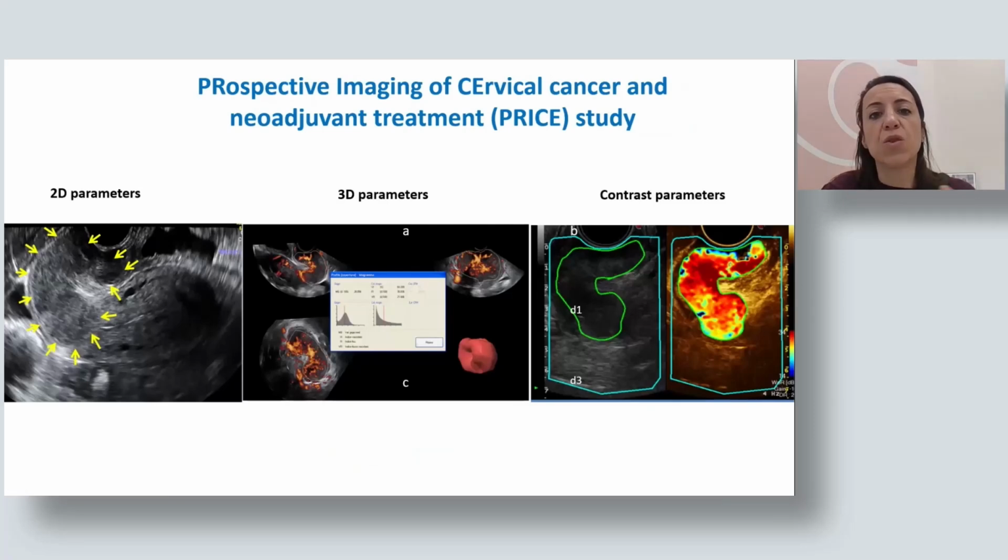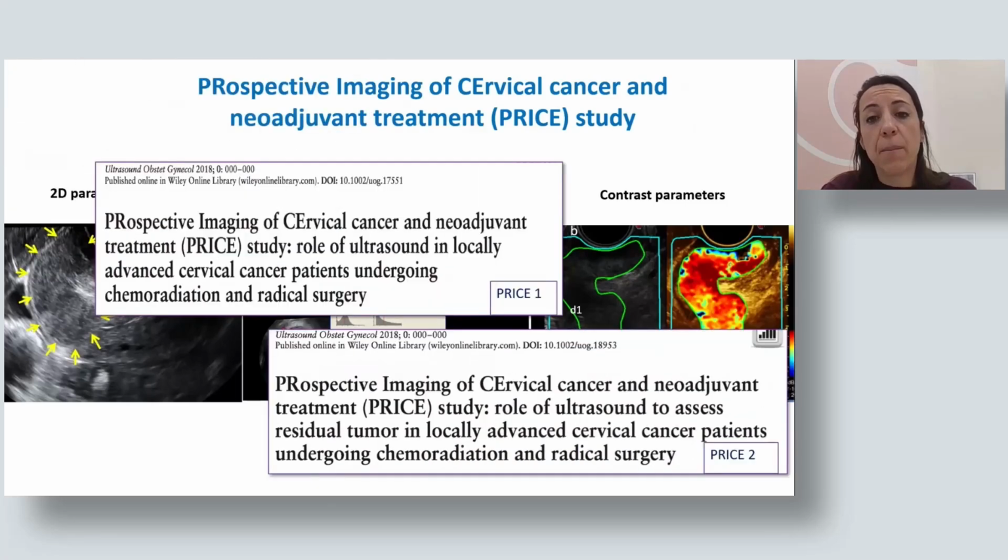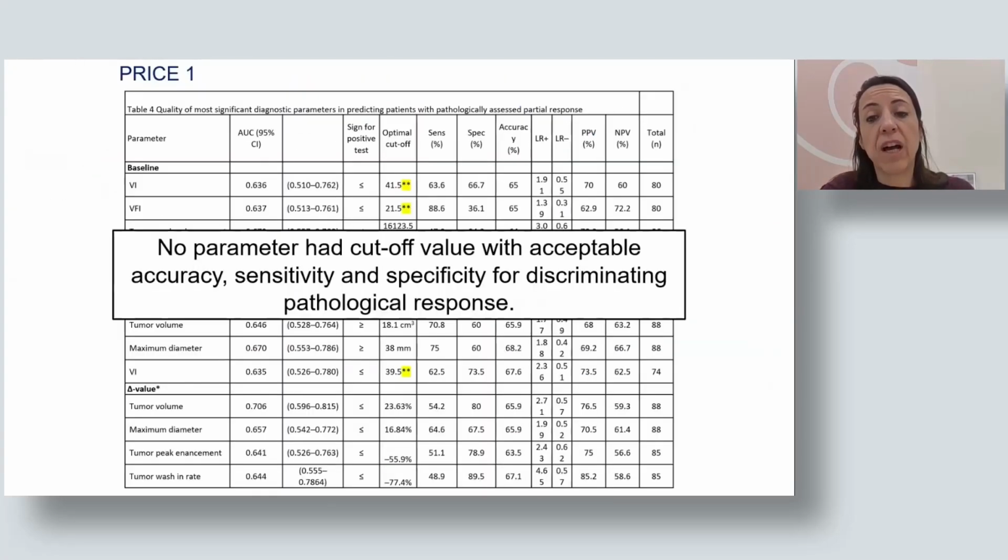We also assessed 3D parameters and contrast parameters with ultrasound examination, but up to now, there are no parameters with high accuracy, sensitivity, and specificity able to discriminate between patients with a complete response and those without response.